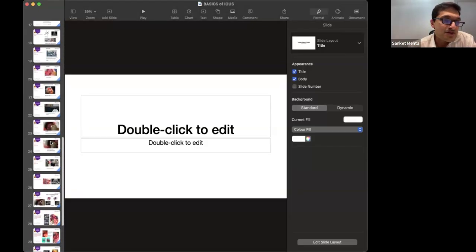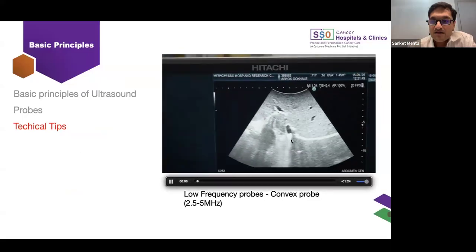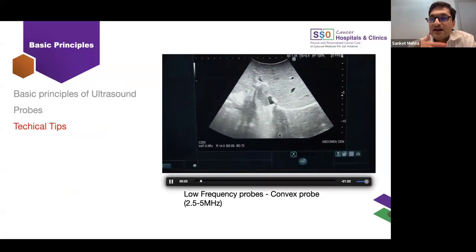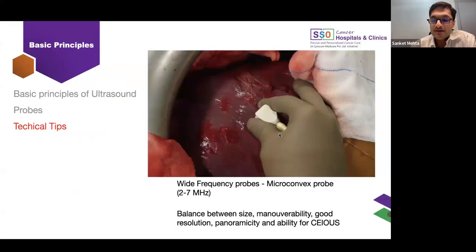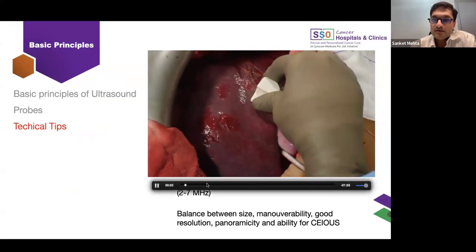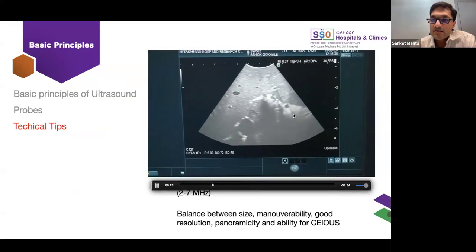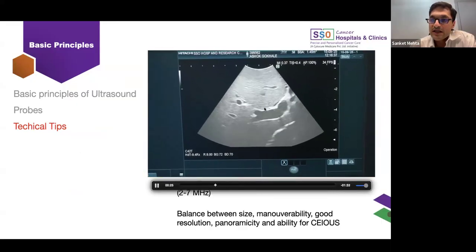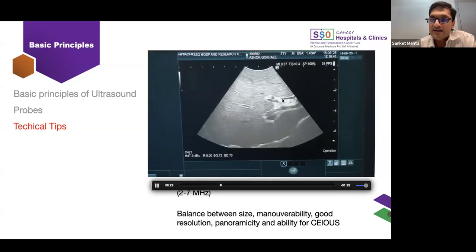I can perhaps show one of those. So the face of the Mickey Mouse is the larger portal pedicle. Just one minute, this one. So this is the Glissonian pedicle. You can see the thick fibrous layer, and this is the hepatic artery.